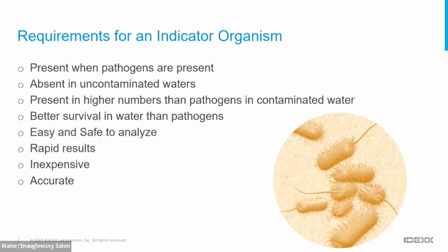Things that can make the water unhealthy could be different viruses, different bacteria, different organisms. And there are way too many different types out there. To look for them all is very difficult, time consuming, and can be expensive. It could actually be dangerous for the lab personnel. So rather than spend all that time, energy, and money looking for anything that could be in there, we look for something that will indicate that the water has been contaminated.